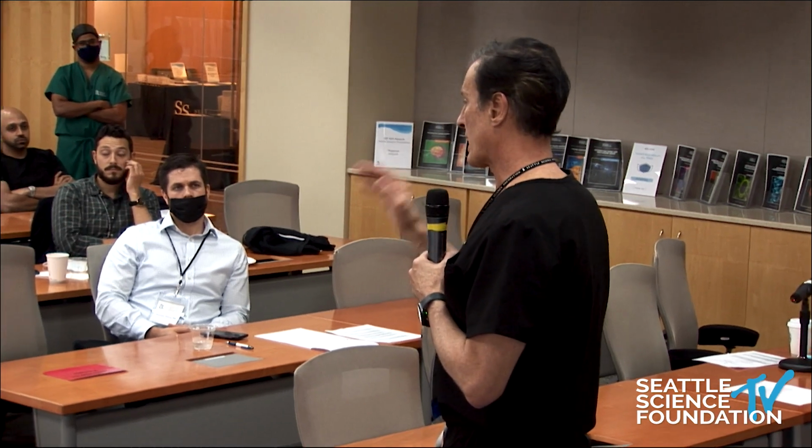Fractures happen all the time to go to the posterior wall. It's never a contraindication, or even a relative contraindication. You can fill to the posterior wall. Retropulsion means nothing. Do not use the word retropulsion as a surrogate or a substitute for the signs and symptoms of neurologic compromise. Never use that, because you're confusing things. Of course there's retropulsion. Any thoracolumbar junction fracture that has any degree of collapse at all will have retropulsion.